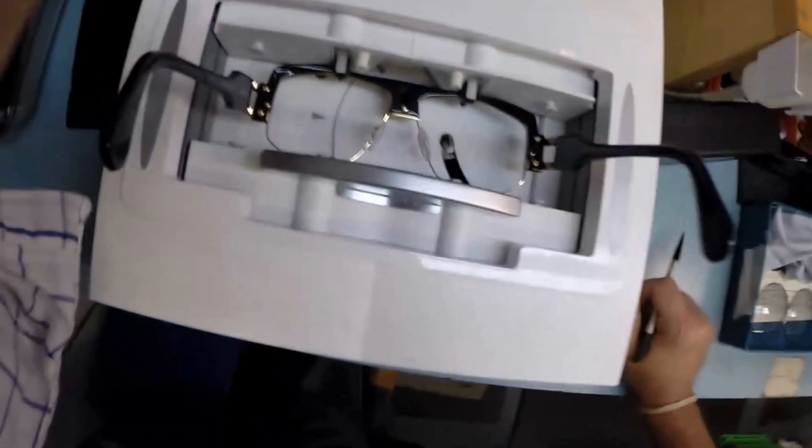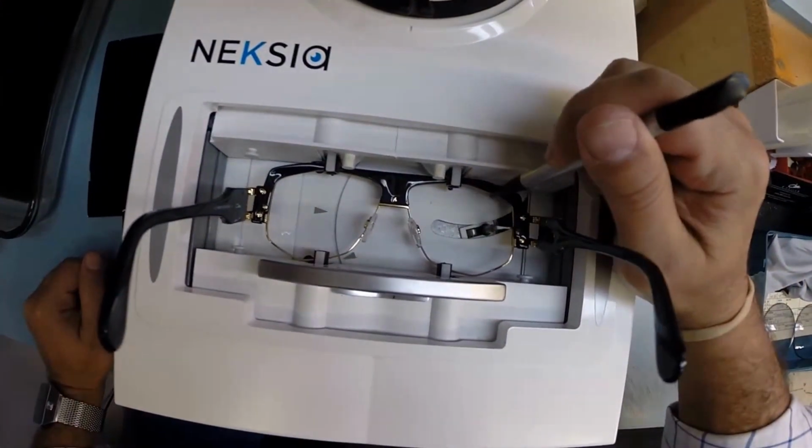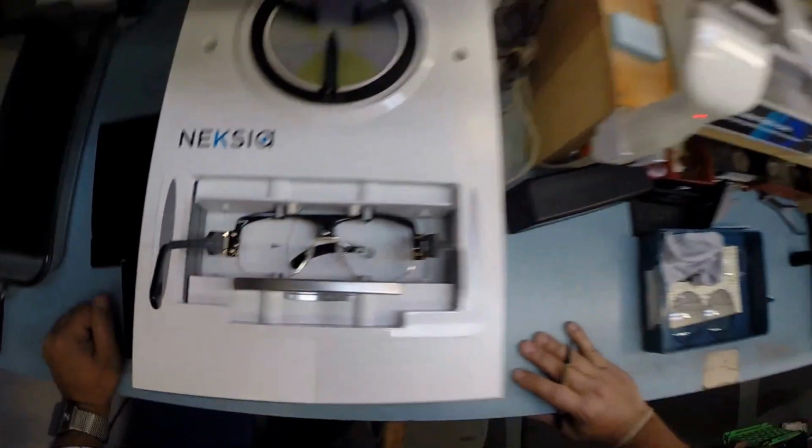Everybody wants to know, how does the computer know what shape lens to cut? This is why. A little stylus goes around and traces the inside shape of the right side of the frame before doing the same thing on the left.